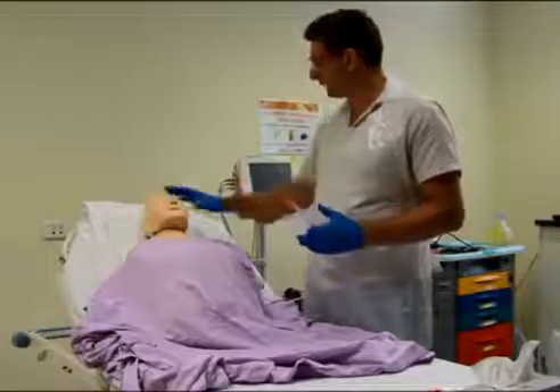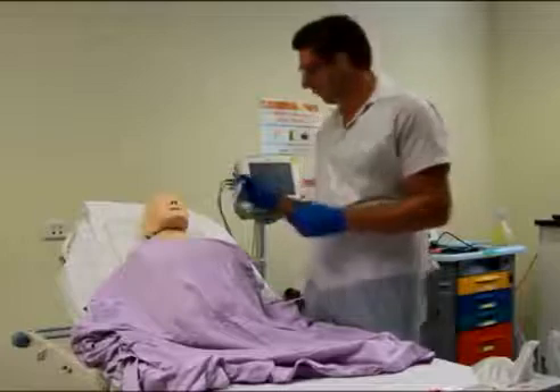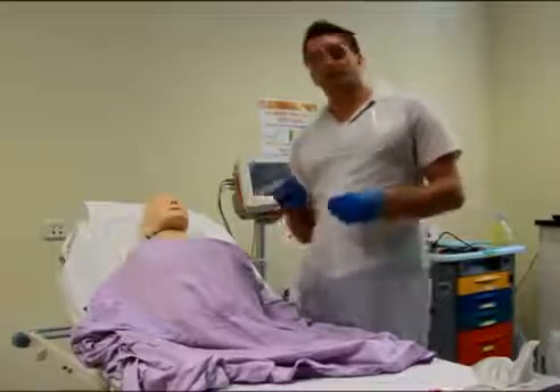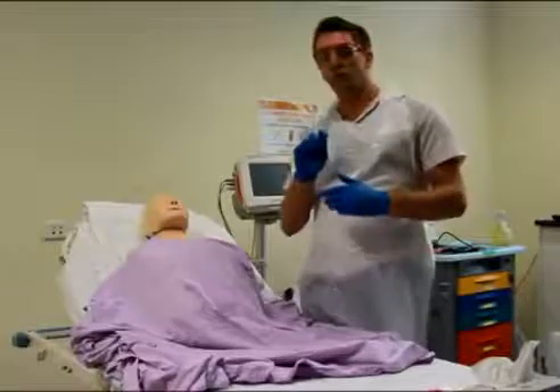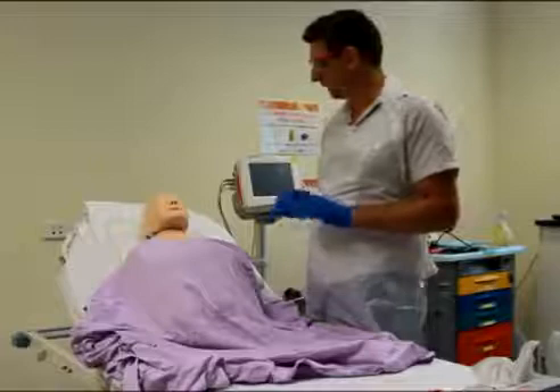Have the person sitting up with their head rested against the back of the bed, because a natural reflex is that when you poke anything up your nose, they're going to pull back. If they're trying to sit up, they're going backwards while you're trying to push with the tube — no one's going to win and you're going to contaminate your sample. We need as good a sterile sample as we can.